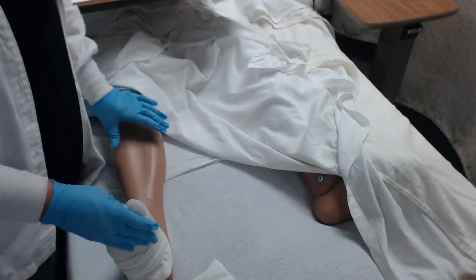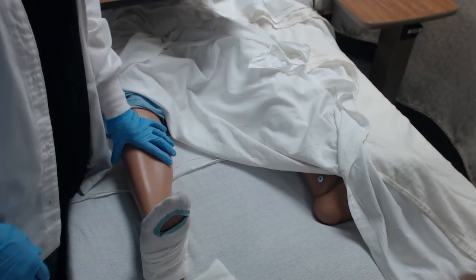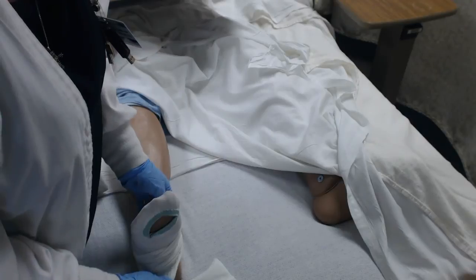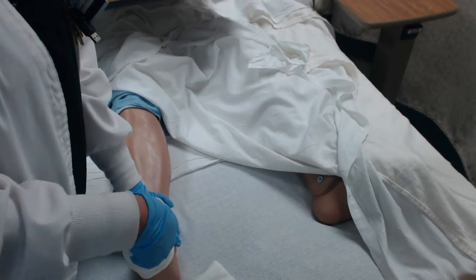We're also going to make sure to ask the patient, do you have any numbness or tingling? That would be another clear indication that we need to remove the stocking. To remove the stocking, you would just pull down from the extremity and backwards out, gently.